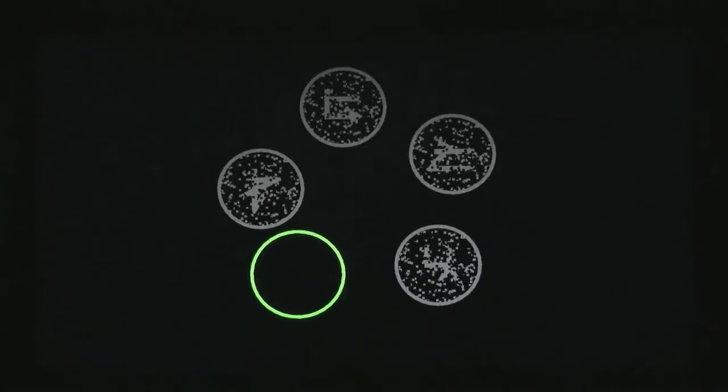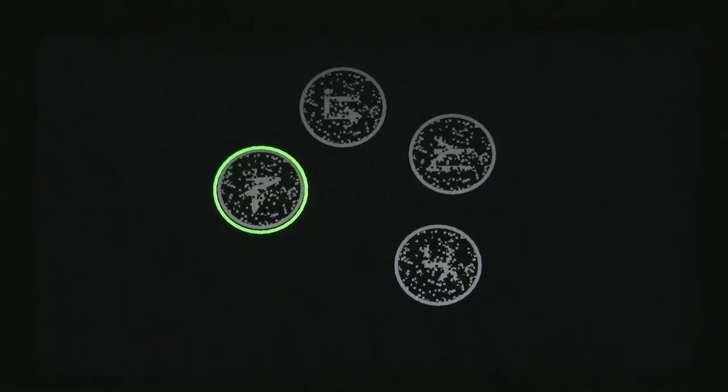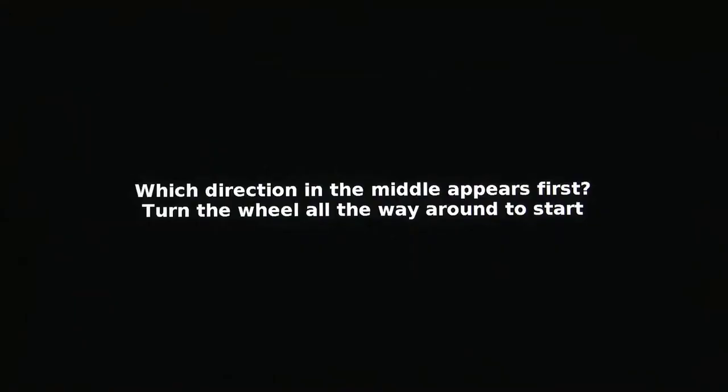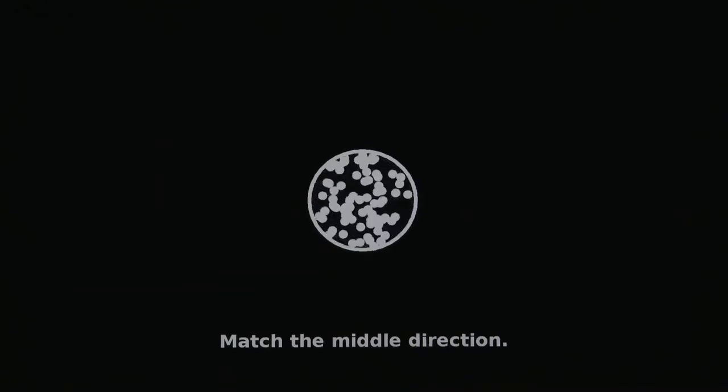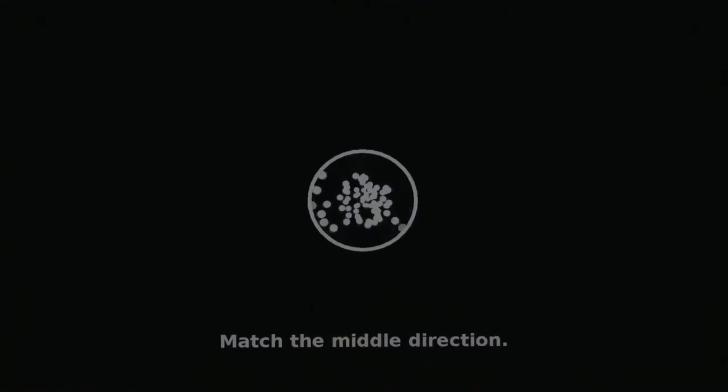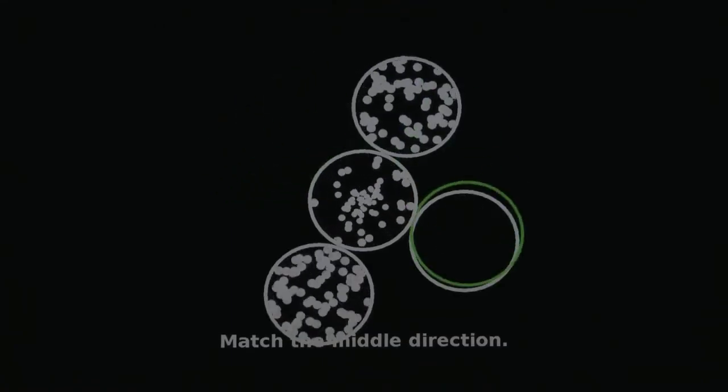The final test is motion memory. The patient is tasked with remembering a motion pattern and then finding it among other motion patterns. Cognivue uses 3 types of motion patterns: planar motion, which is left, right, up, or down; circular motion, which is clockwise or counterclockwise; and radial motion, which is motion from or to a focal point.